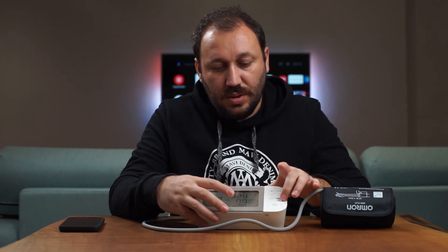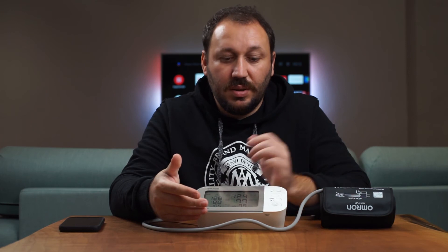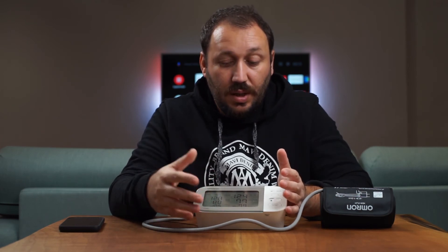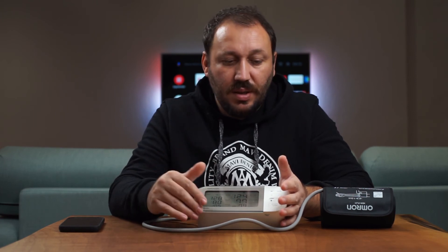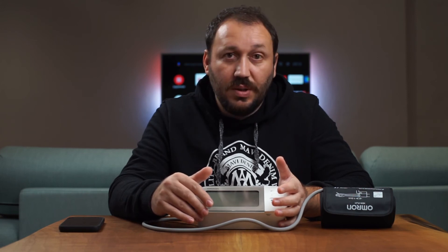You can also set up a second user in the app and follow each person's readings individually. Omron is a really good brand — my family has been using one for five years with no issues. The older version doesn't have Bluetooth; I wanted something smarter and more connected, so I got this version from Amazon.